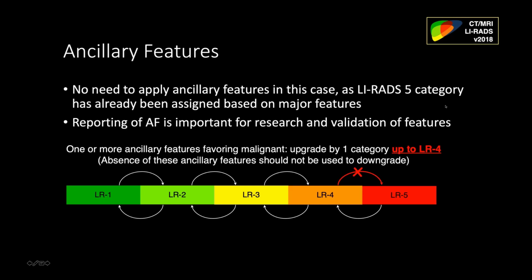So ancillary features, like Dr. Elsayes had said in the beginning, are really important because I think, and I think a lot of other radiologists believe as well, they allow you as the radiologist to add more value, not only to research, but to validation of other features. So I implore you, and we implore you, to use these ancillary features, apply them, and use them as you feel fit.